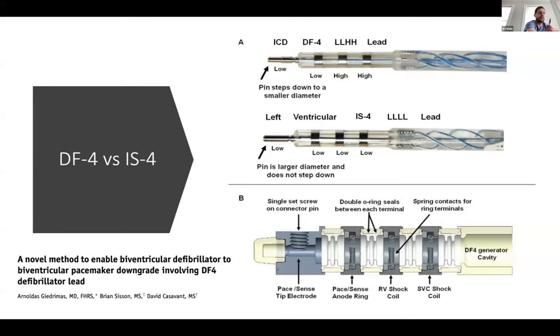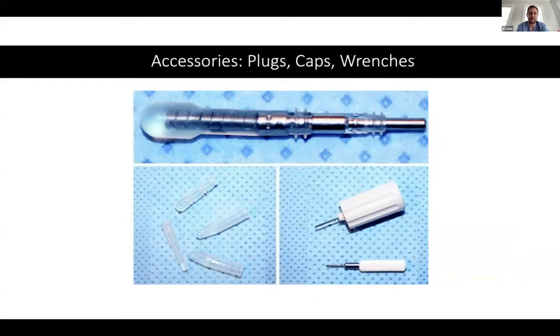And I don't know if you can see my screen, but I like to draw out ahead of time what the pattern is, so I know the layout. So I just draw that out. And that way, when they're trying to put everything in and you don't have the glasses on or what have you, you can be on standby to tell them where everything is located.